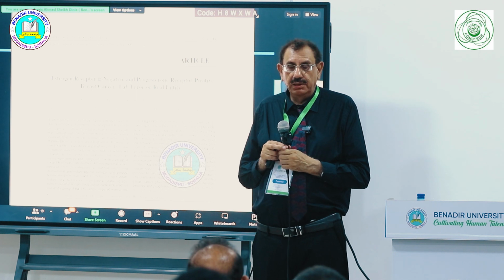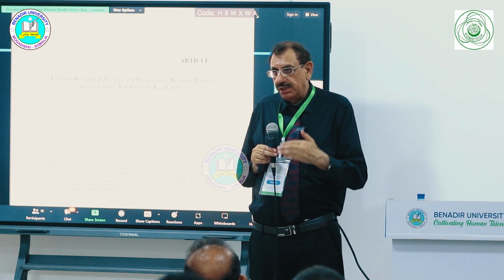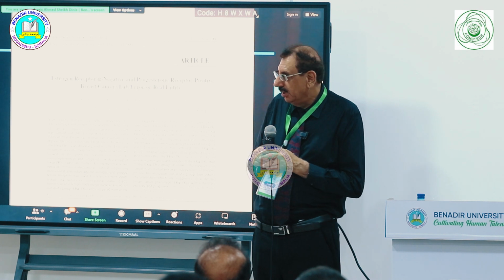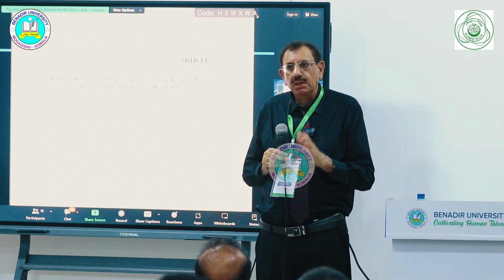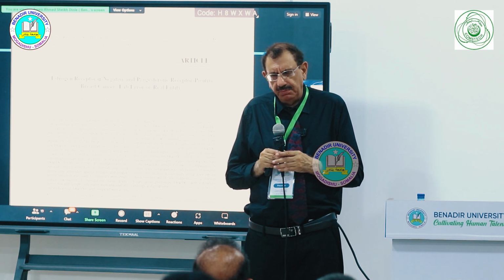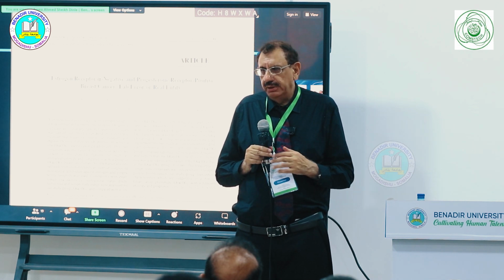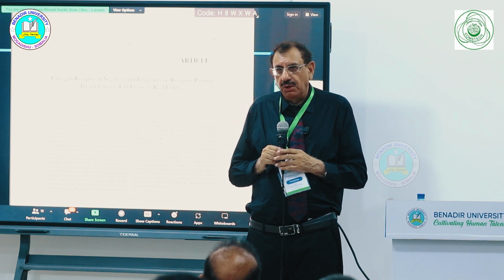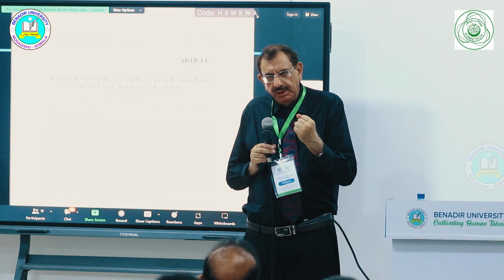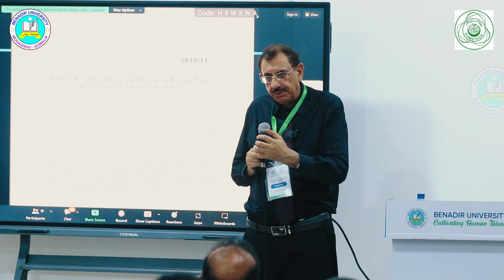So in that case, I always get the estrogen receptor ER repeated, and even if on the second go ER is negative and PR is still positive, I will write a note that a very small percentage of patients genuinely may show progesterone receptor positivity and estrogen receptor negativity, and there may be multiple reasons for that. One of the reasons which I noted initially was that with the antibodies which we use from Dako mostly, the affinity of the antibody with progesterone receptor was much better compared to estrogen receptor.